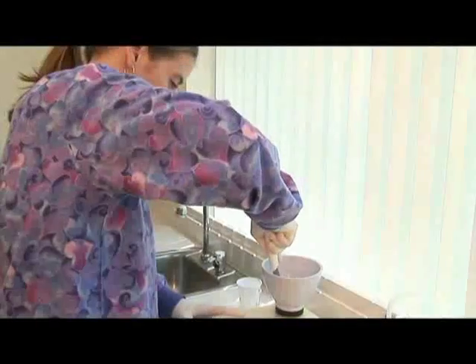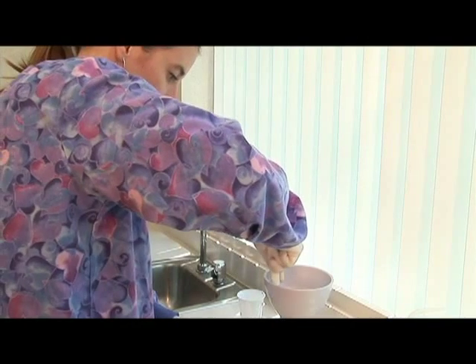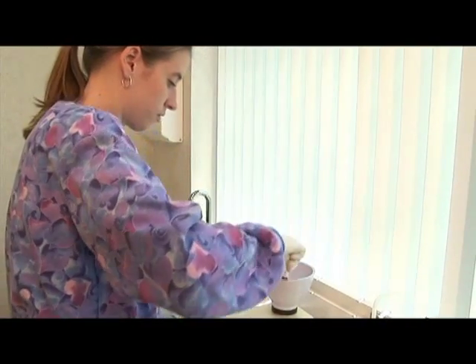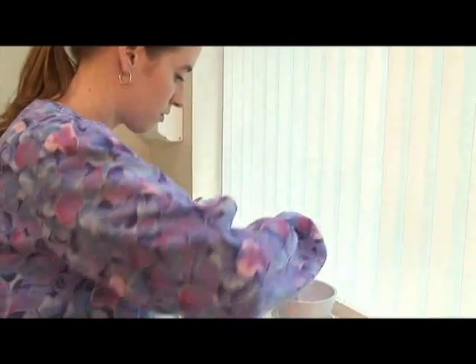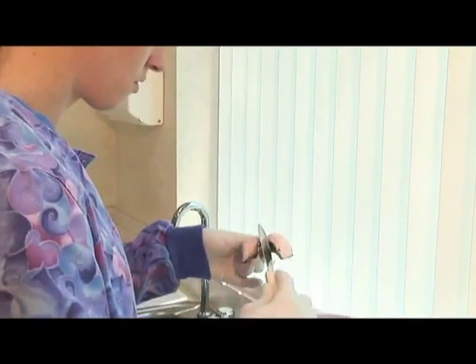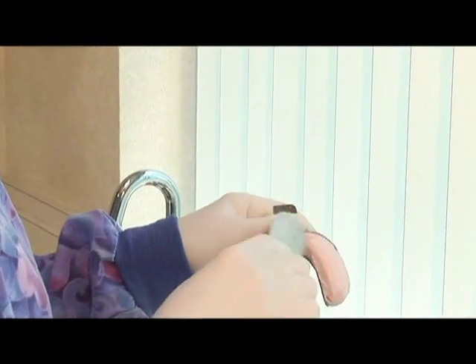The procedure for mixing the irreversible hydrocolloid, the alginate, is to mix it according to manufacturer's recommendations. The water is first placed in the bowl and then the powder added to it, and it is mixed until a homogeneous consistency is obtained. The tray is then loaded, being careful not to overload the tray. Load just to the top of the impression tray.